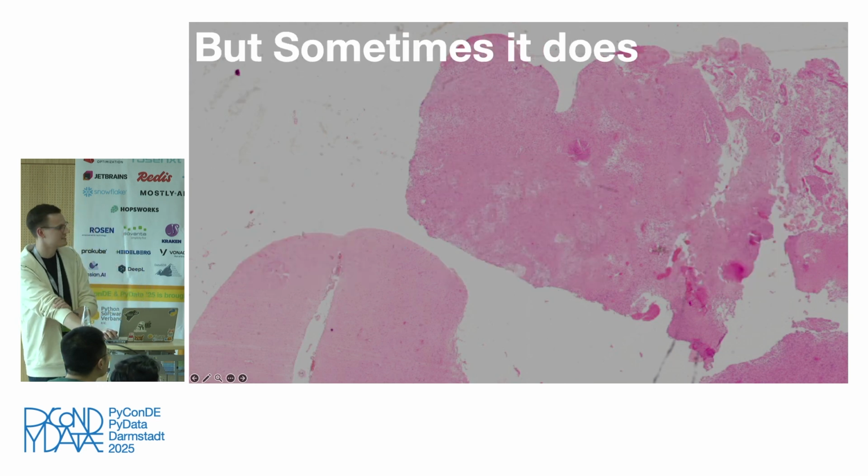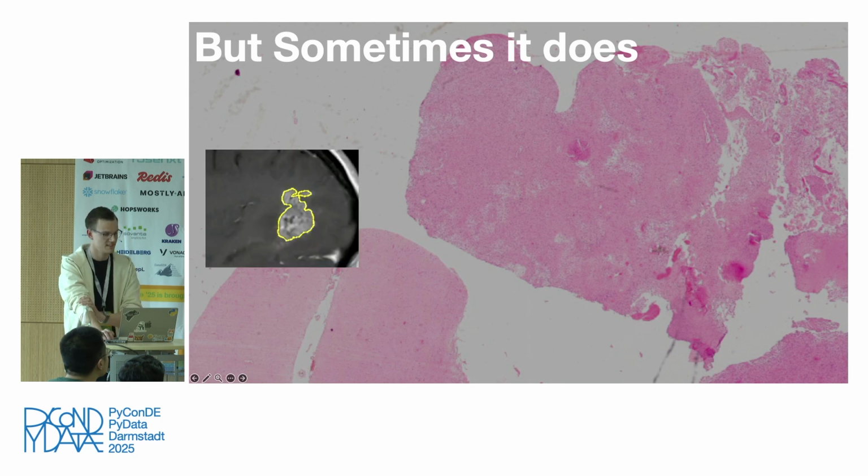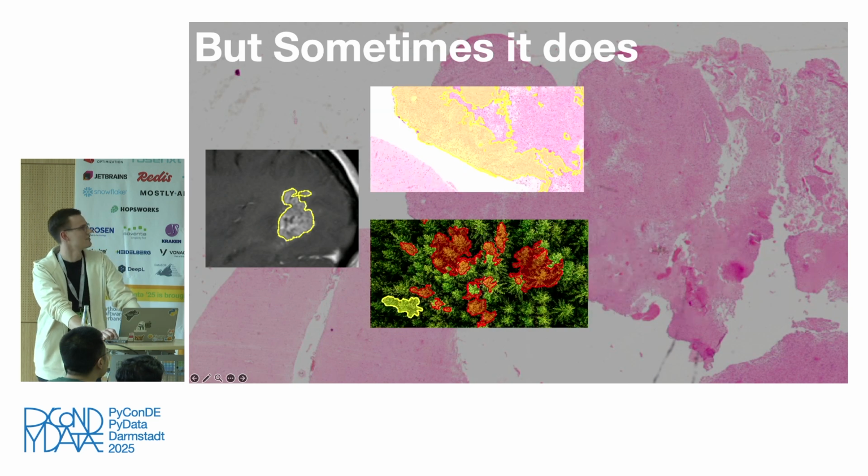But to be fair, the conventional computer vision part doesn't always work. Sometimes we have to do machine learning. As a little example, and once again to rant about radiologists, this is a brain tumor in radiology. You simply have to use a region growing algorithm, click on the tumor itself, and done. You can also use watershed algorithms to do it fully automatically. I tried the same with my tumor and my trees. Didn't work out really well.